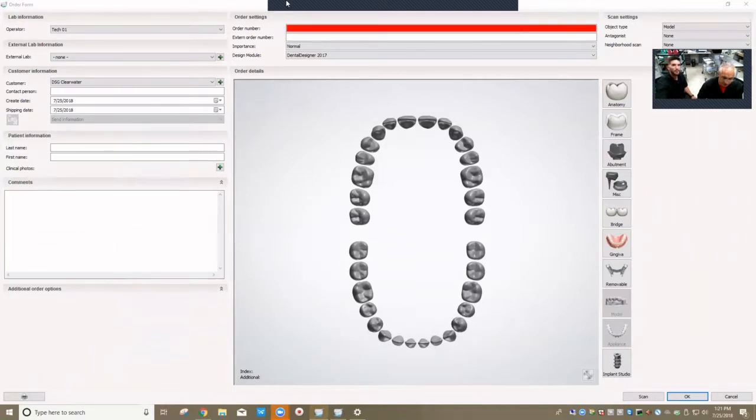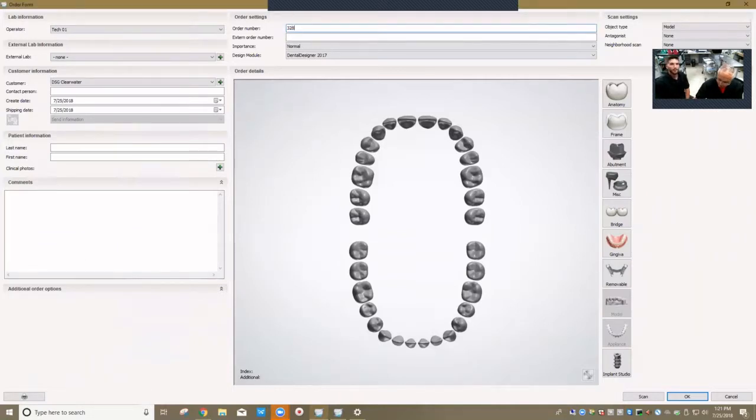All right, so Daniel's going to start filling the order form out here. Looks like you're missing some numbers there. We're going to start by putting the pan number in. And then we will assign it a PO. You can find POs on the PO clipboard. It'll be unique to each case.